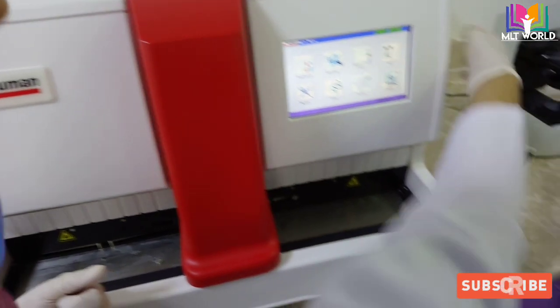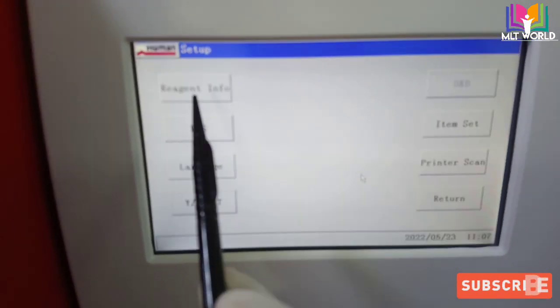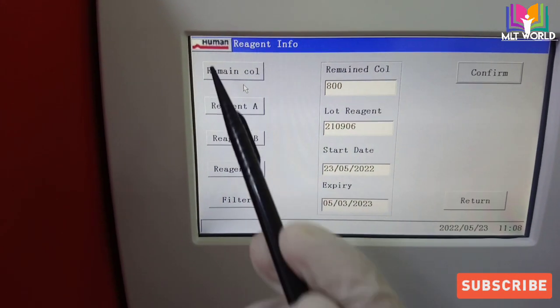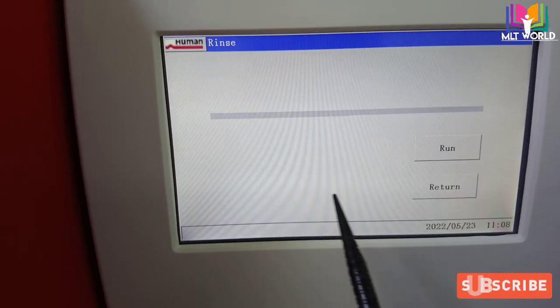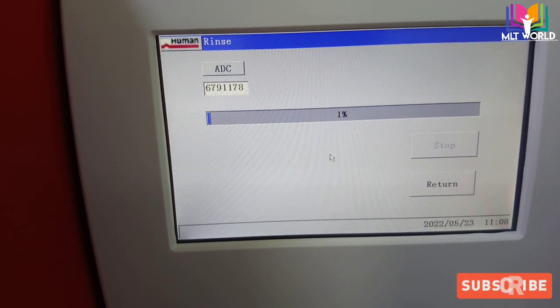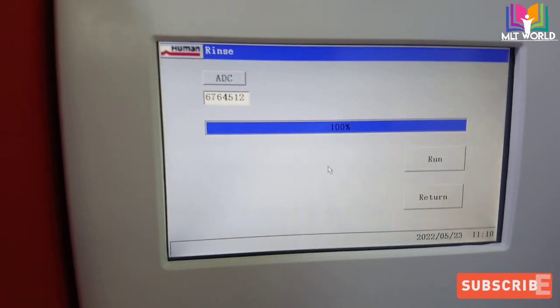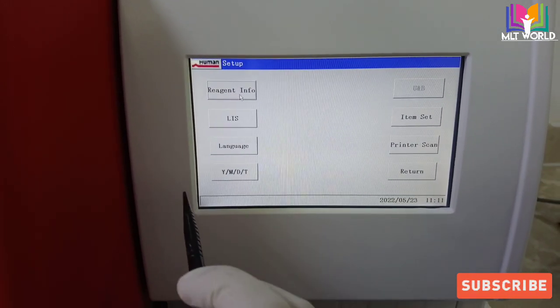Now we will remove our accessories and discard the old filter and column in general waste. Then we move to the screen to update our changes. Go to Setup, then Reagent Information. The remaining column count automatically shows 800. We click Confirm, then Run, and wait for it to reach 100%. Once complete, we return to the main screen.